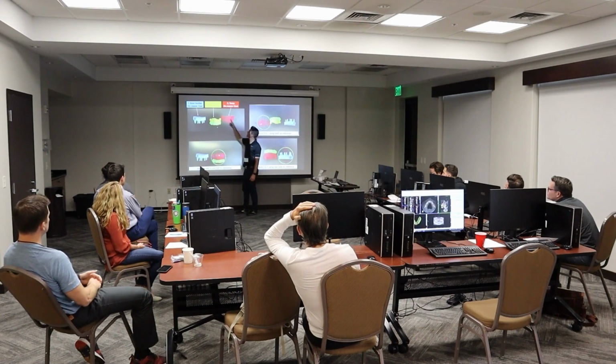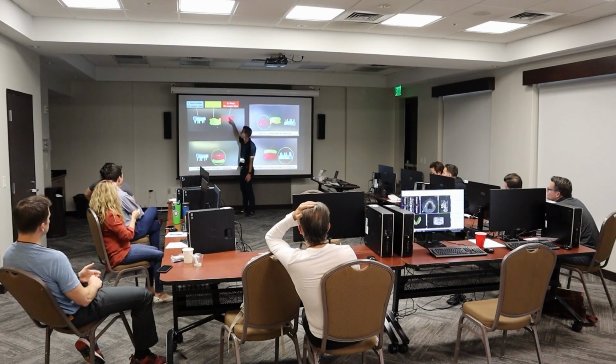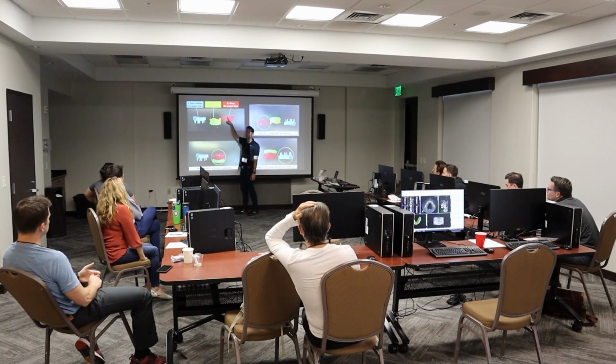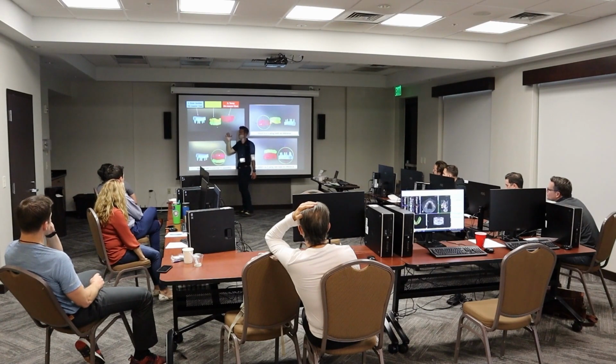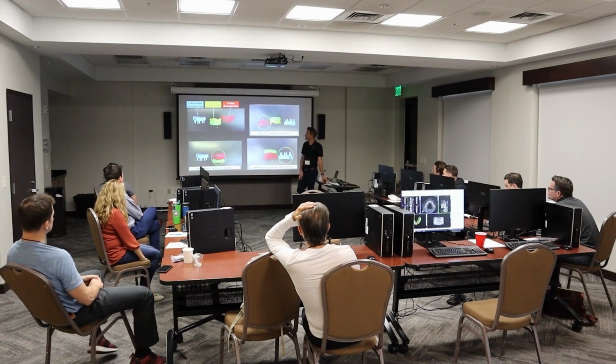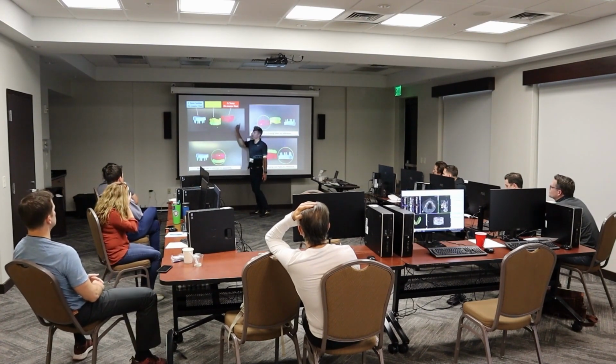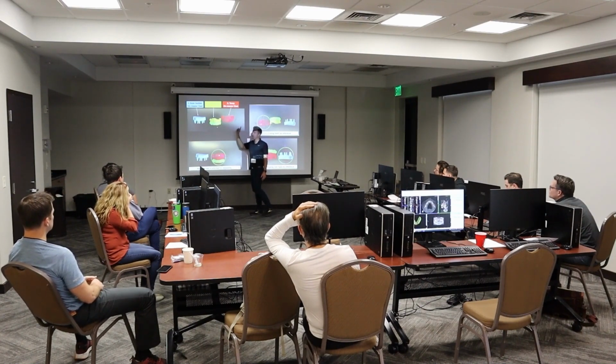The 3rd scan is the temp on the master cast. So remember I said after you pour up the master cast, make sure the temp is on there and go grab an iTero scan and get a little bit of this data in there, that stone base, because this is the important part here. Before you give it back to the patient, scan that temp on the stone. And you can do that with an iTero or an intraoral scanner. Did you do that also with the desk scanner? Yep, absolutely. You can just throw it in the box scanner and do the same thing. I'd probably default to the box scanner if you have one, but if you don't, you can use an intraoral one and just make sure you get it to send to the lab.